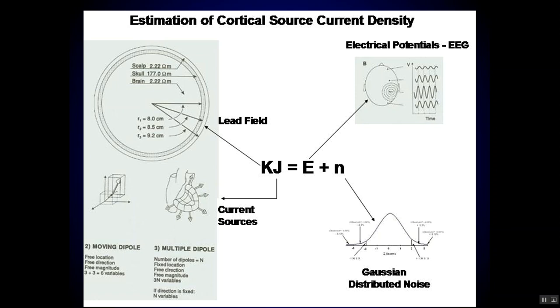It's usually one, maybe three voxels, sometimes four current density vector systems, but usually it's just one or two with 128 or 256 channels. Basically, you don't get much more resolution if you go above 128. So that's called the discrete method, used primarily in neurology.